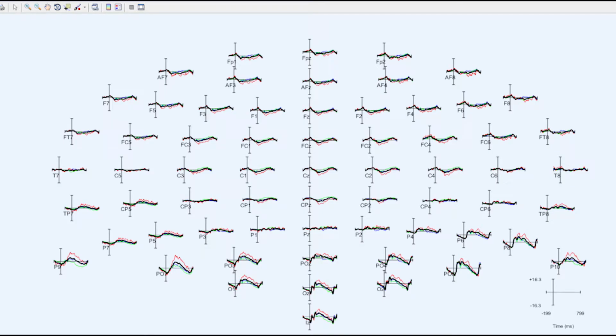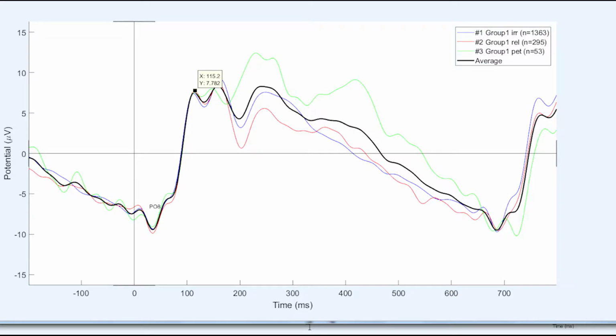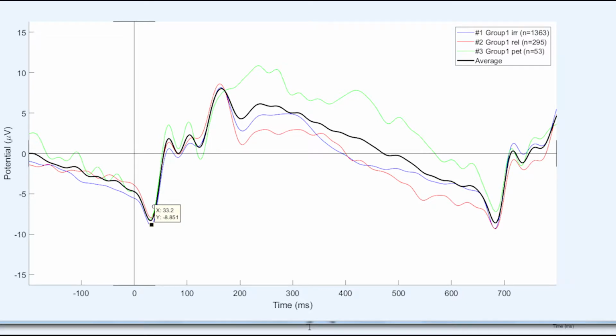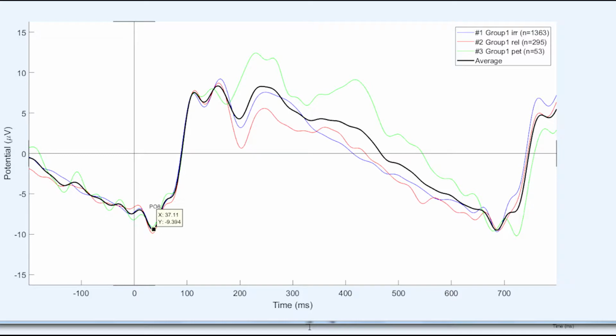In order to identify the first positive peak, also known as P1, multiple channels were assessed closely, which allowed it to become apparent that P08 was in fact the channel where P1 was visible. This process was repeated to find the first negative peak, and again we found that P08 also held the first negative peak. The spike at the end of this plot simply shows the 600 millisecond display of stimulus ending and the next stimulus being shown.